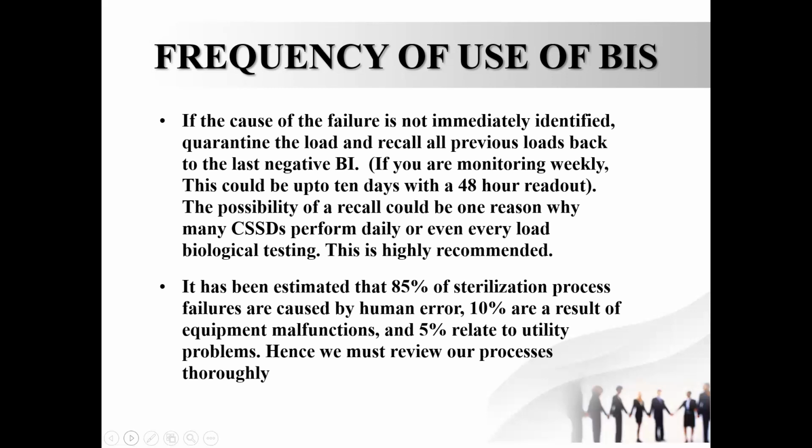Because if you have a failed BI, you have to recall all previous loads back to the last negative BI. So if you are putting the BI only once a week, for example, on Monday, and you get a pass on Tuesday, but next Tuesday you get a failed result, so from last Tuesday to this Tuesday, you will have to recall all the loads which have been issued, all items. Okay? So this is why many CSSDs don't prefer to use the BI weekly.